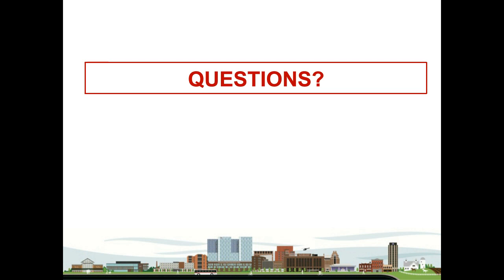This is a question from Nova Scotia Health Authority. Were studies done on using glucose meters on neonatal population? These patients have a tendency to have elevated hematocrit, and will this have an impact on the results? Dr. Dungan, you want to take a stab at this? There are some limited studies in neonatal populations, but again, that's also really critical to look at your package insert and determine that your device is approved in that population.